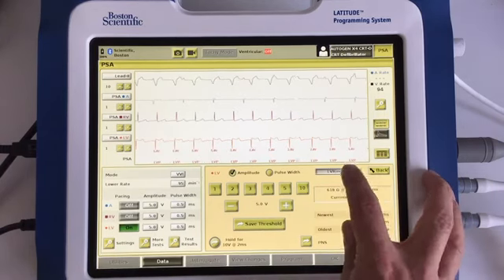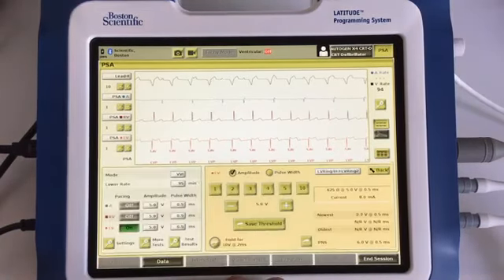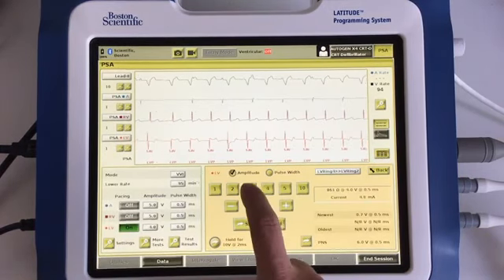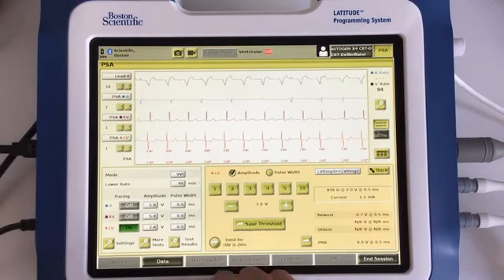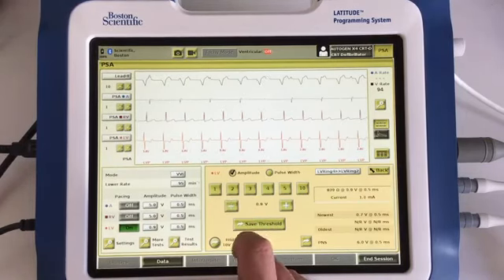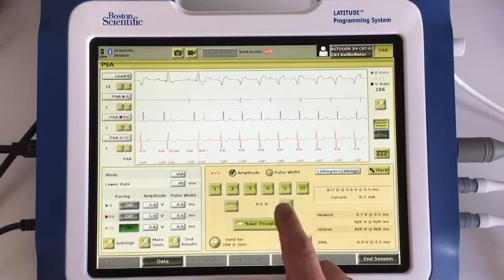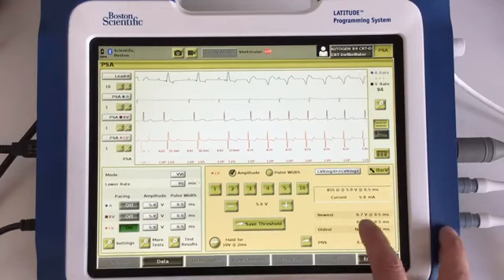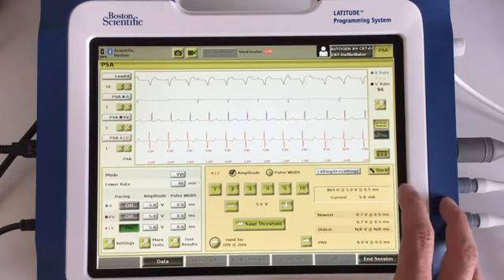So what other options do we have for the 4th electrode? Let's try 4 to 2. So we're currently pacing at 5, so we'll come down from here. This is looking good. Oh, much better. So come down from 1. Okay, so a threshold of 0.7 at 0.5, and that's using 4 to 2. So we've got a good impedance and no twitching at 10.